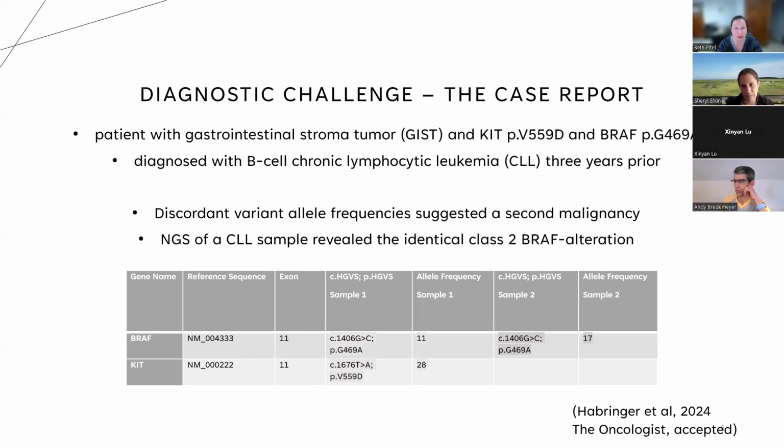And so when I'm looking through path reports for our different testing, sometimes I'll think, oh, this patient has underlying CML, let's just keep that in mind when we run our RNA panel. If we do see something on ABL1, that's probably another tumor, and we need to check the H&E to see if it's infiltrating, those kinds of things.